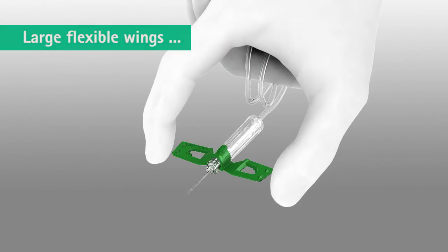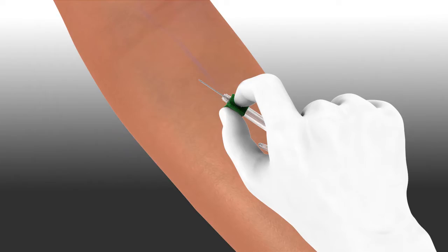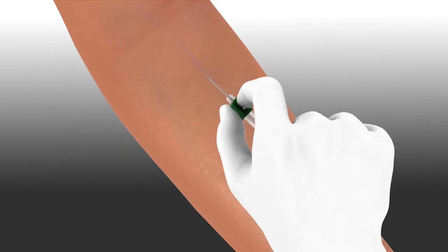The large, flexible wings on VinoFix Safety are interlocking and are designed with a special grip to allow for convenient handling and facilitate venipuncture.